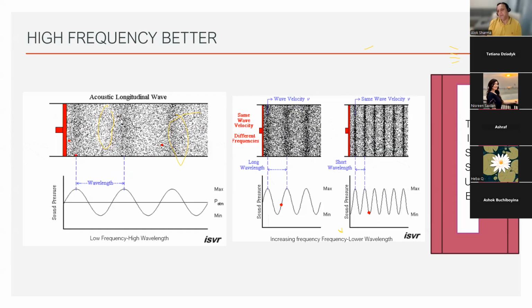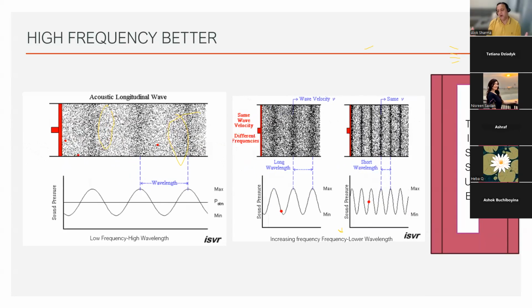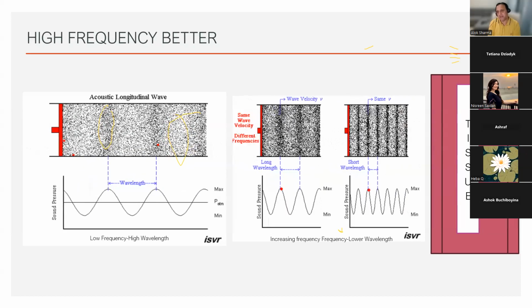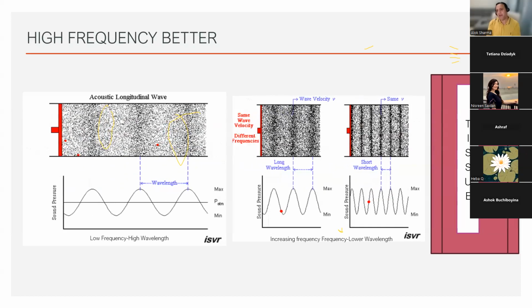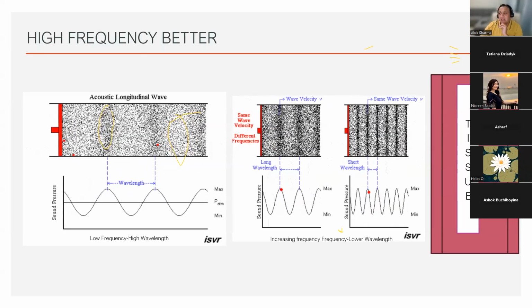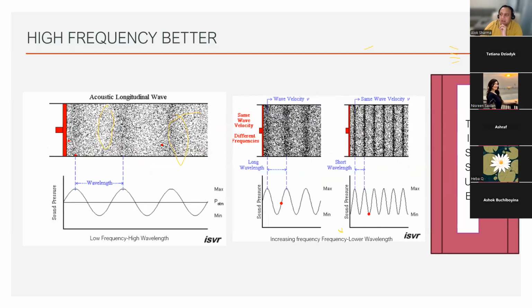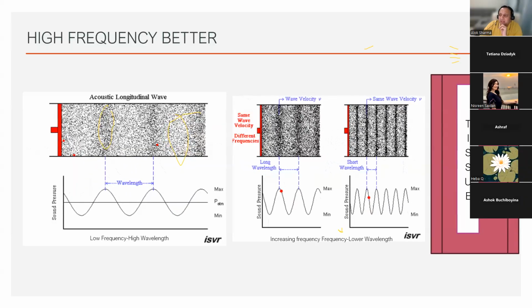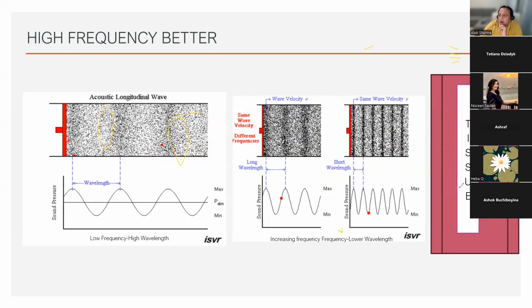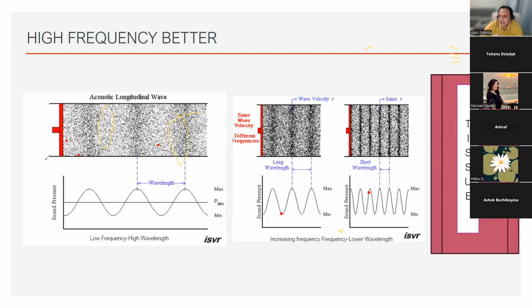It's like a spring. If you compress a spring and let it go, it will go with more energy. On the other hand, if you compress it less, it will go with less energy. But if you just leave a spring compressed, eventually it compresses and relaxes until it stops. So there is an element of energy transition taking place, and we call these compressions and rarefactions. Now, waves in this situation can travel with slightly different frequencies, and how that then interacts with tissue determines how good your image quality is.